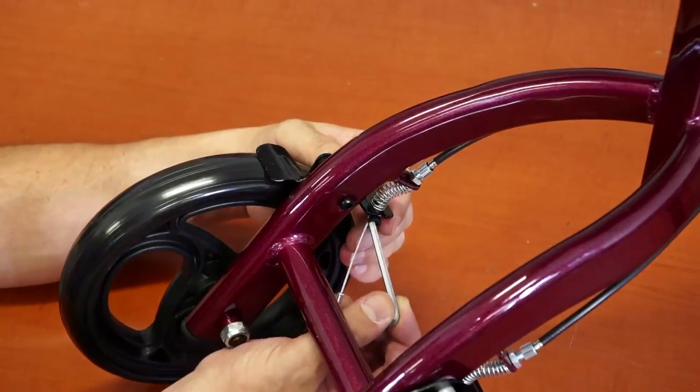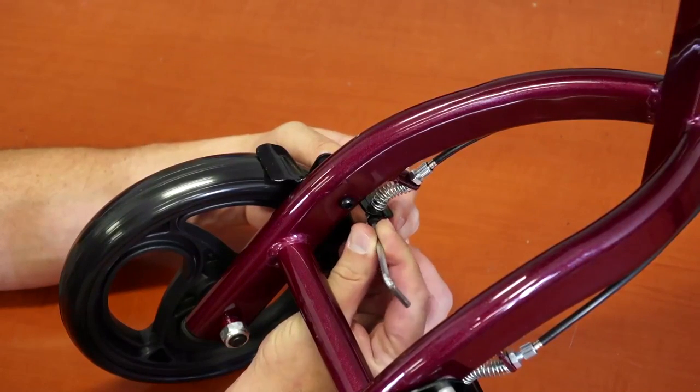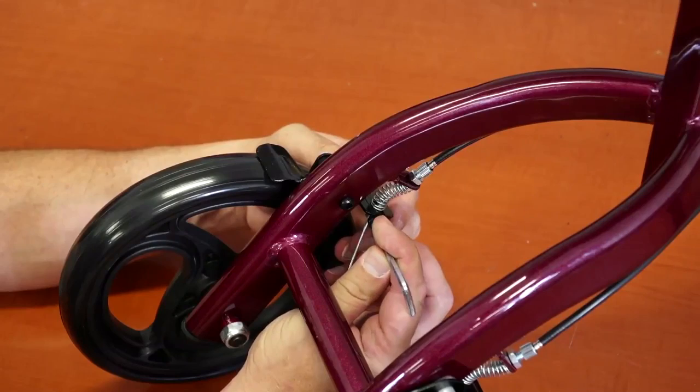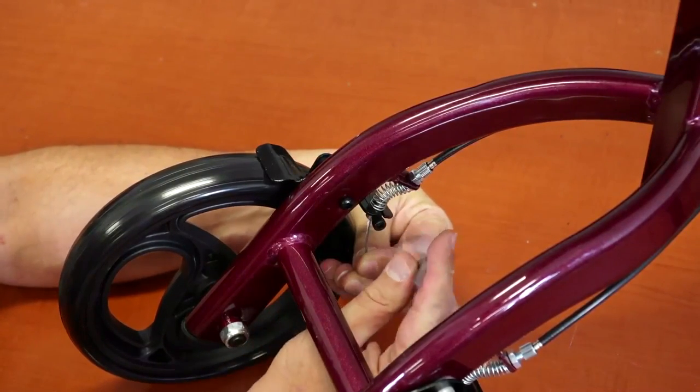At some point, you might want to adjust the brakes of the scooter. To do that, use an allen wrench to loosen the screw that holds the brake wire in place. Adjust the wire as desired. Do not forget to tighten the screw after you are done.